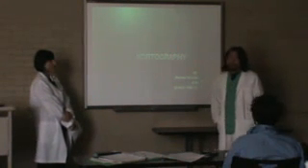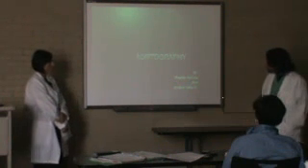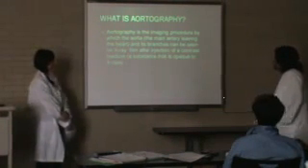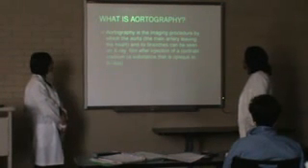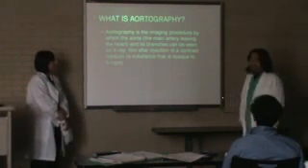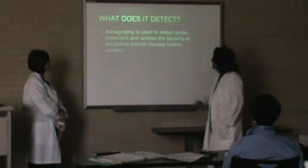We're going to be talking about what aortography is, what it detects, its indications, its contraindications, and the procedure itself. So let's get started. What is aortography? Well, aortography is an imaging procedure by which the aorta and its branches can be seen on X-ray film. And that's after the injection of contrast medium, which is what we're going to talk about next.